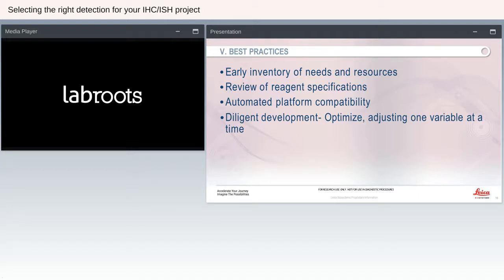They have different capabilities, different specialties, pros and cons about all of them. A lot of people will decide they want to do something and then find out that their instrument actually cannot do that fully automated or cannot do it at all. So it's good to know the actual limitations of your automated platform if that's the route you're going to go or that you need to go.